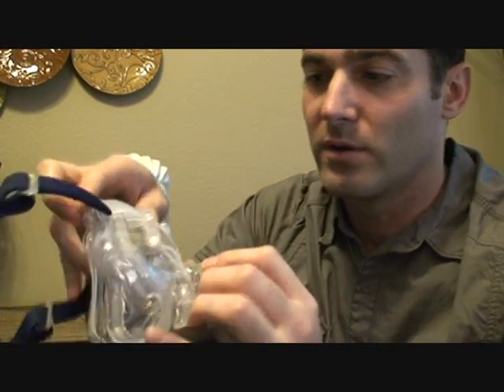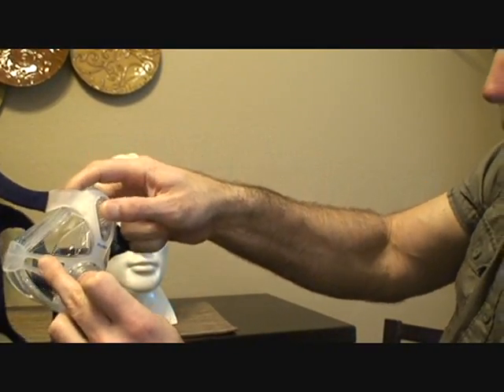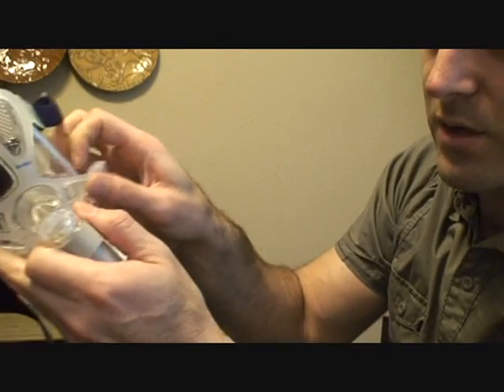To remove the frame, put a finger on each side and your thumb right in the center, then push in and it pops off. The bottom part is a little trickier — you have to pull it out because there's a little plastic tab in here that catches.